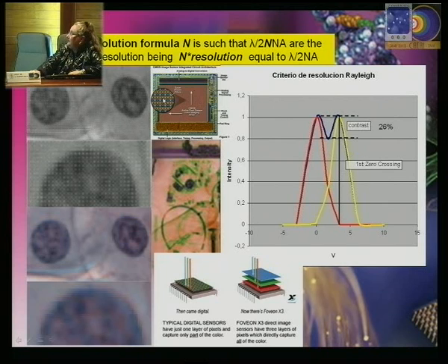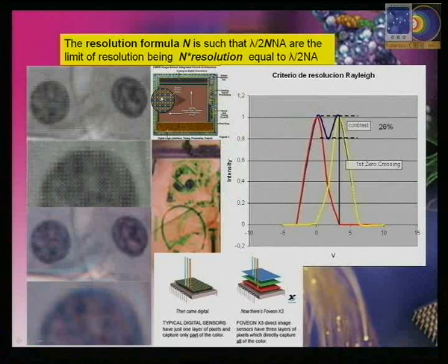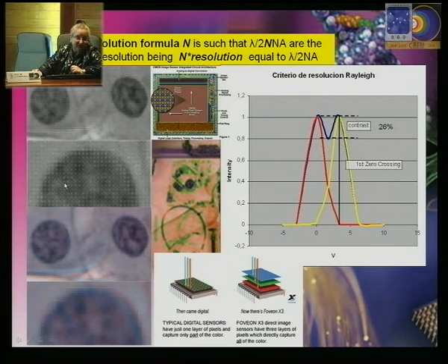In general, it's two green plus one red and one blue. What happens is that from the spatial resolution of the chip, for example, if this is 1000 by 2000 pixels, 1/4 of the pixels belong to the red detector, 1/4 belong to the blue detector, and 2/4 belong to the green detector. The green detector is the main detector.